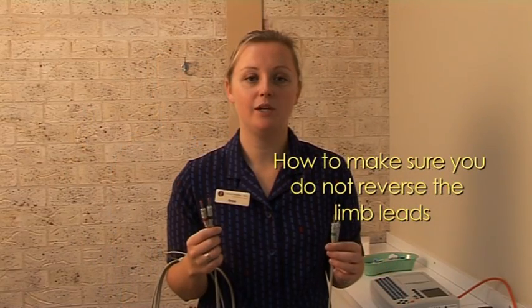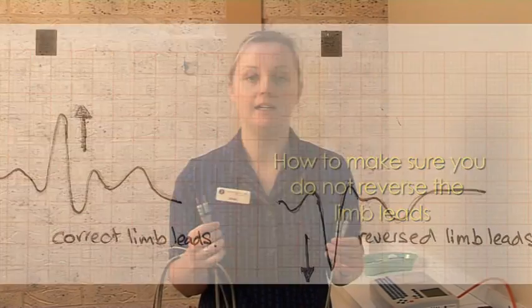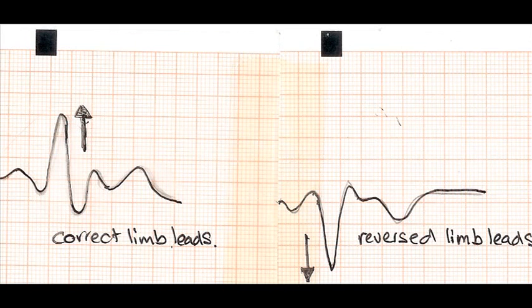There is a simple and quick check the collector can use to ensure the leads are in a correct position. Check the AVR lead has a downward deflection of the wave. The lead 1 waves will be seen to have an upward wave.